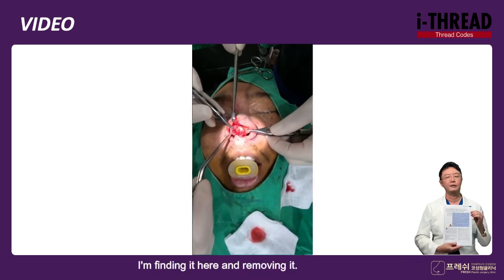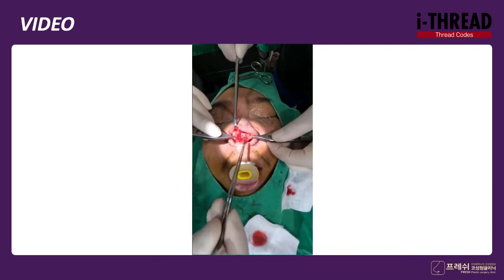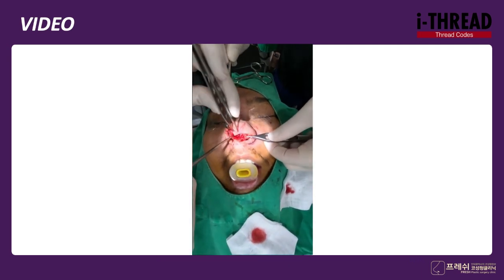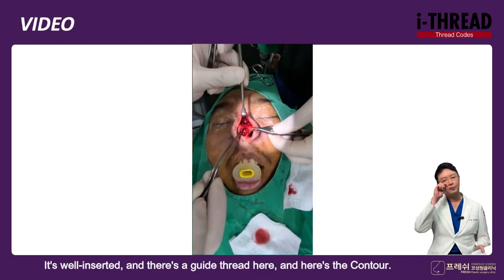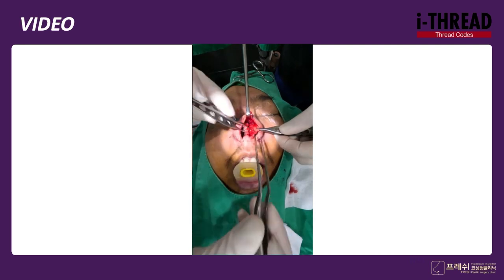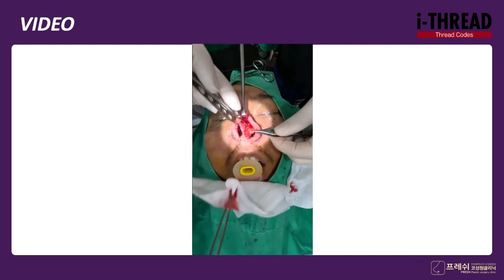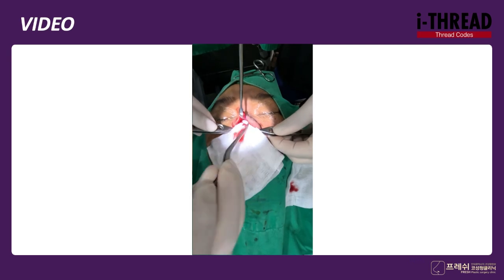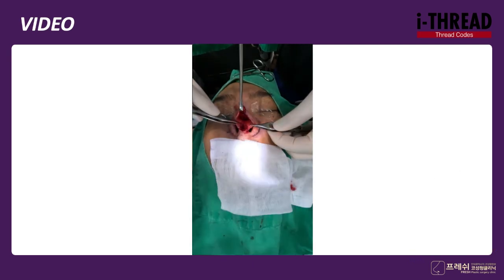I'm finding it here and removing it. It's well inserted, and there's a guide thread here, and here's the contour. So that's how I'm removing it.